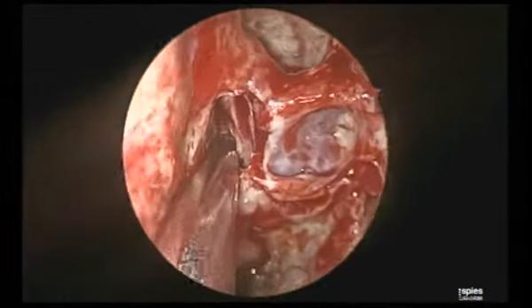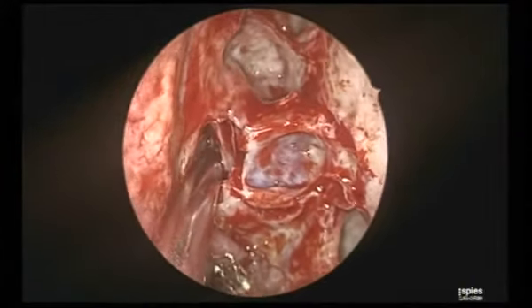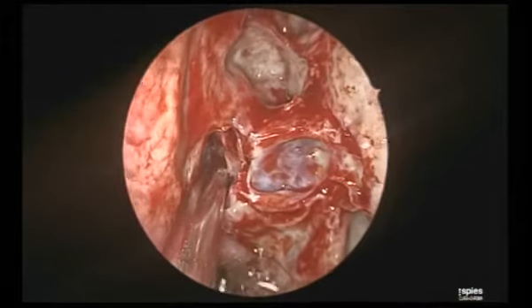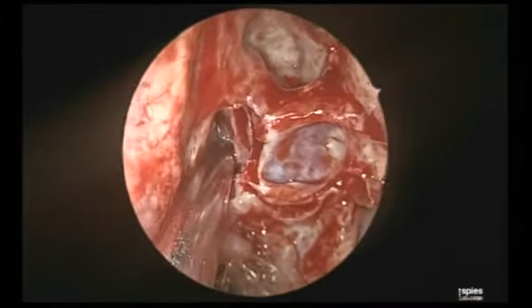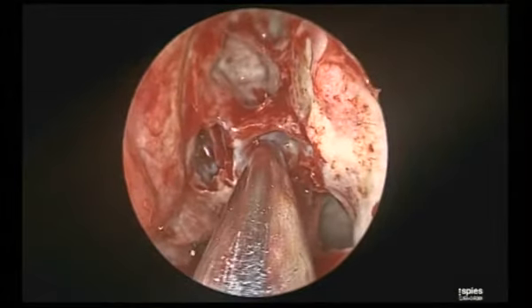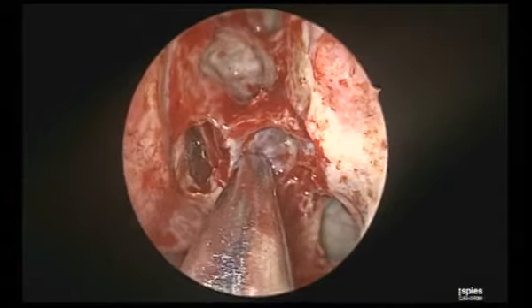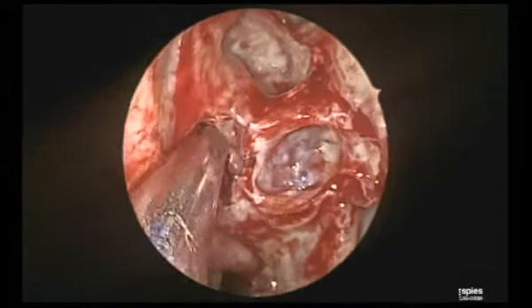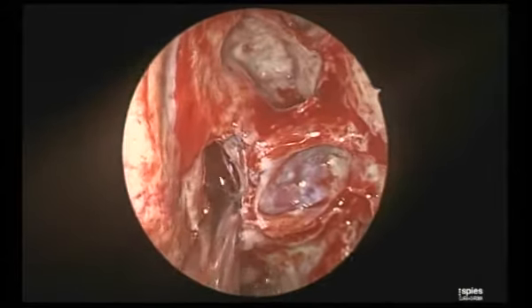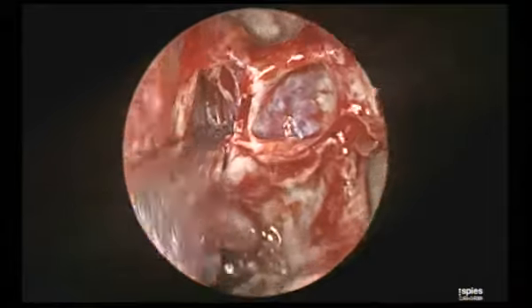What I am wanting to know is to have a landmark which tells me this is the posterior limit of posterior ethmoid. So that is the ostium of the sphenoid. I want to see the ostium before doing posterior ethmoidectomy, because if I keep doing posterior ethmoidectomy, I may accidentally enter into the sphenoid and can damage the structure, particularly when there is anatomical distortion like Onodi or something.